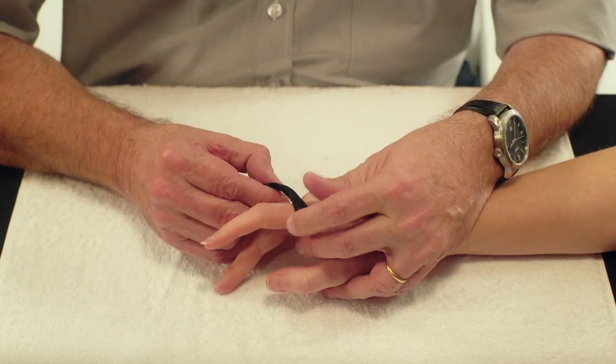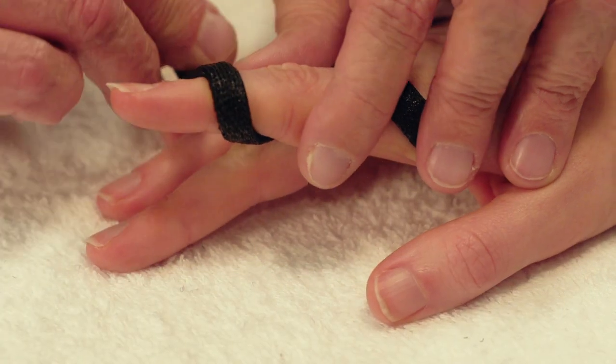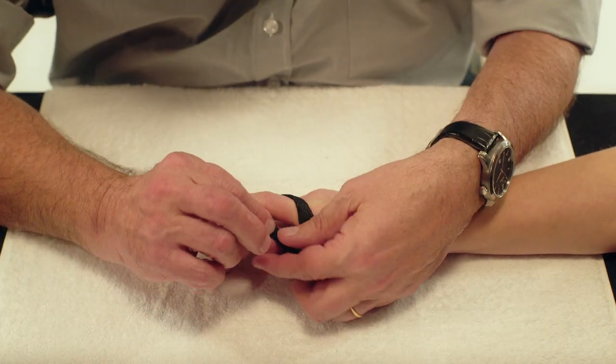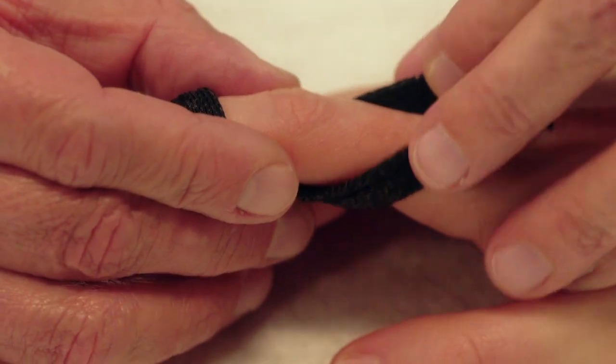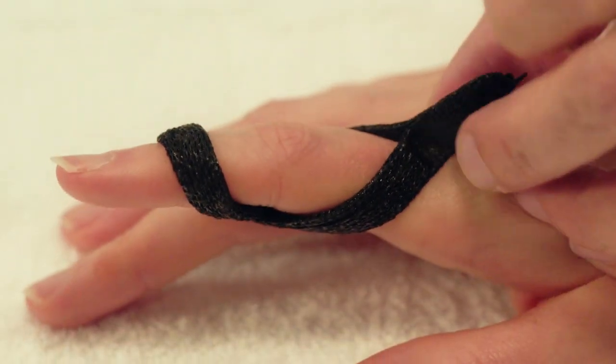Starting at the dorsal portion of the proximal phalanx, cross the material around the lateral side of the finger and criss-cross over the volar flexion crease of the PIP joint. End on the dorsal surface of the first phalanx at its proximal border. Press the two ends firmly together.